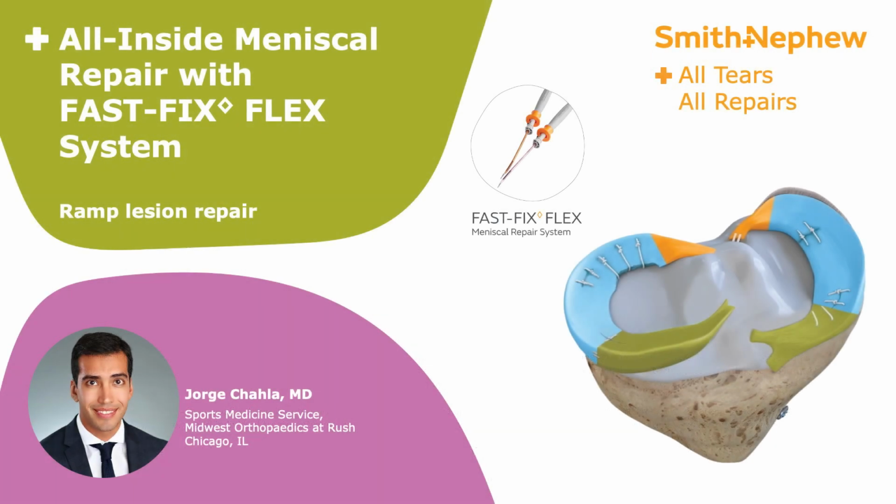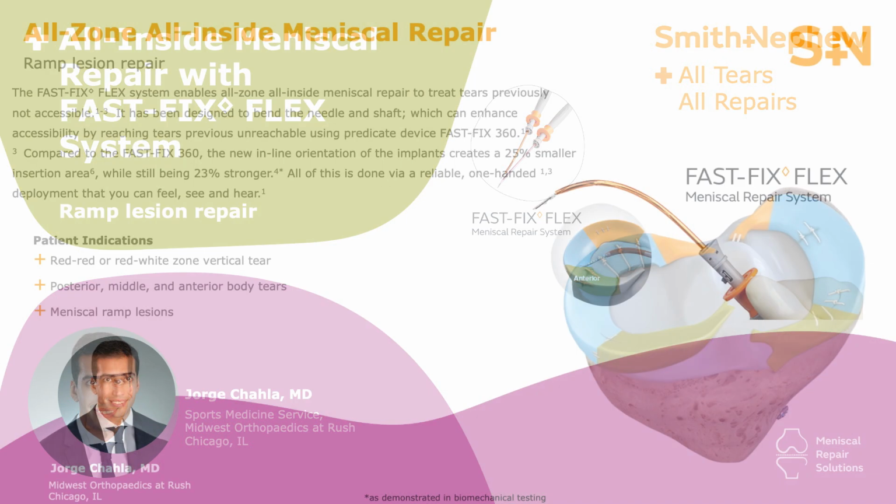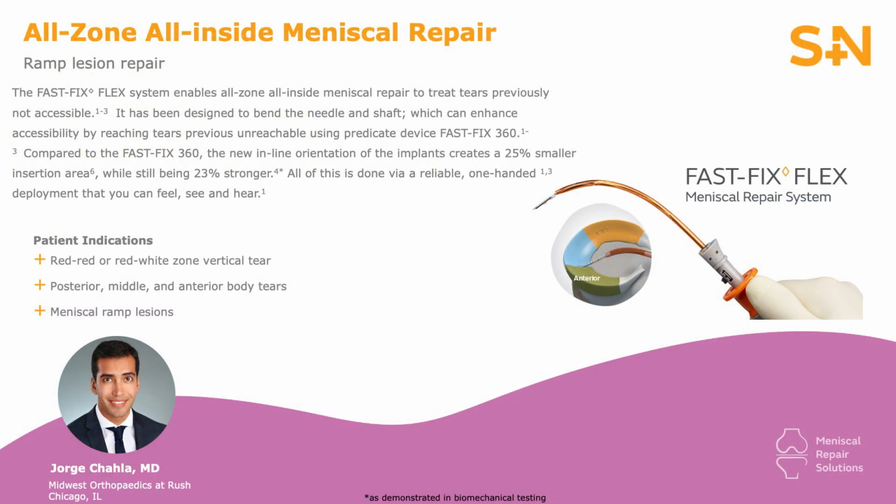This is Dr. Chahla from Midwest Orthopedics at Rush in Chicago, Illinois, presenting a technique for ramp lesion repairs using FAST-FIX Flex. Patients with evidence of acute disruption of the meniscocapsular junction with associated increased meniscal translation are indicated for repair of the ramp lesion, especially in the setting of an ACL tear.